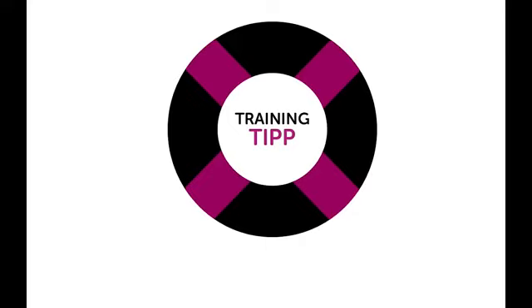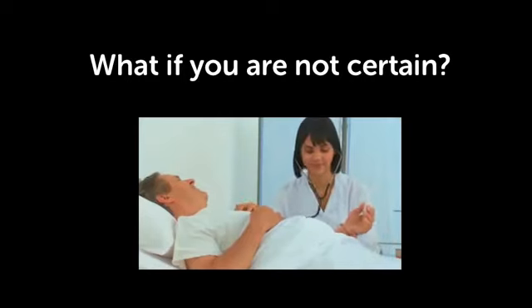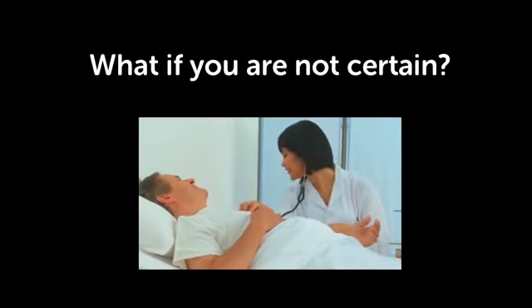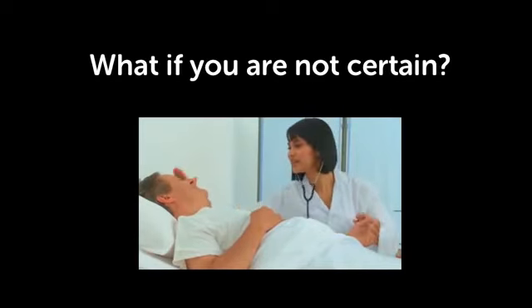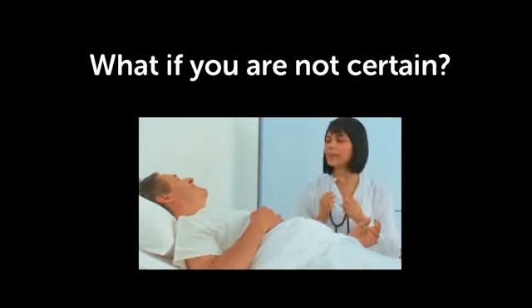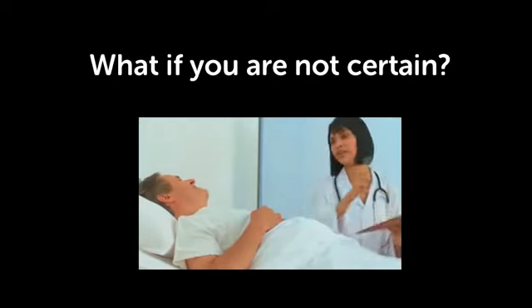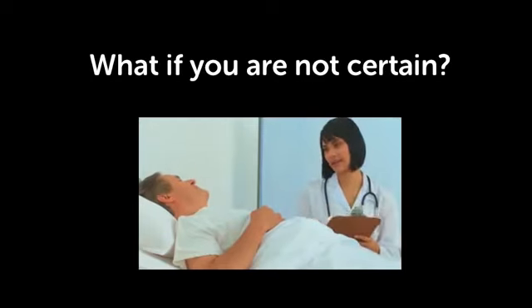Are you ready for a little training tip? If everything fails, why not try the good old stethoscope? By using the stethoscope at the beginning in every patient, you will also improve your auscultation skills, and you will be able to get a better feel not only for the presence of aortic stenosis, but also if aortic stenosis is severe or not. However, no matter what you do, don't forget to smile just the way the nurse smiles in this little short video.